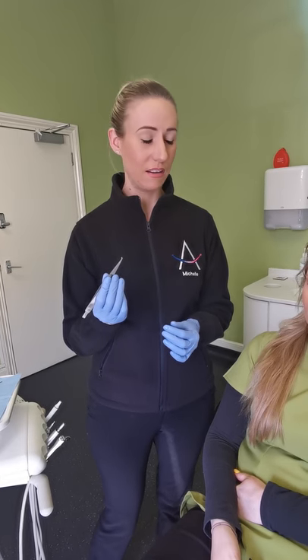This is a quick video to show you how to re-hook your power chain back onto your brace should it come loose. The best thing you can use from home would be eyebrow tweezers. This is the closest thing we have.